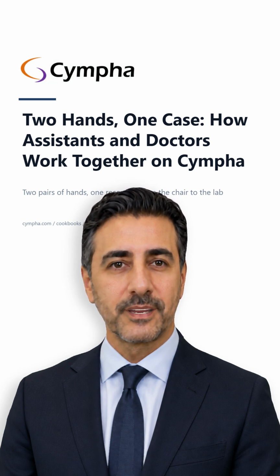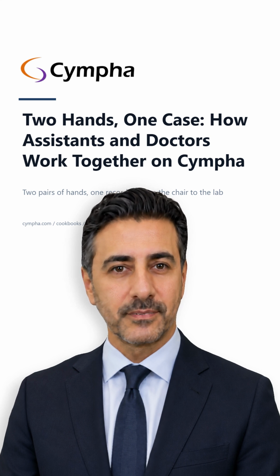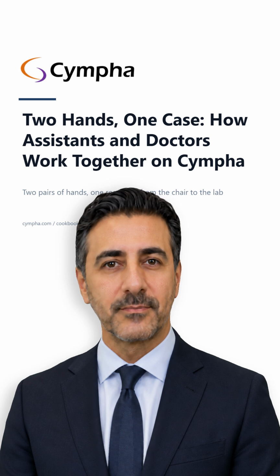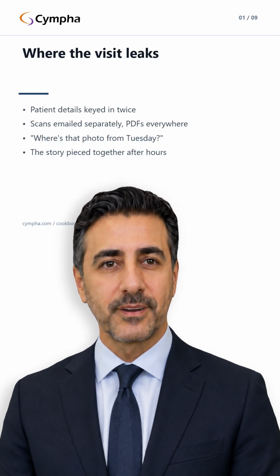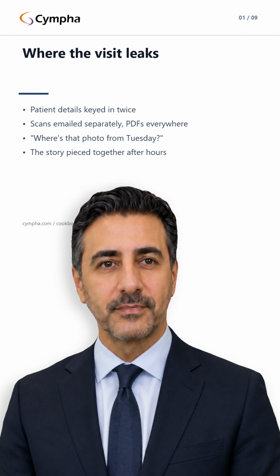Most dental practices run on two pairs of hands. The assistant seats the patient, takes the photos, captures the scans. The doctor walks in, examines, and decides. The hard part has always been the seam between them, the place where one person retypes what the other already did. This is how cympha closes that seam, all the way from the chair to the lab.